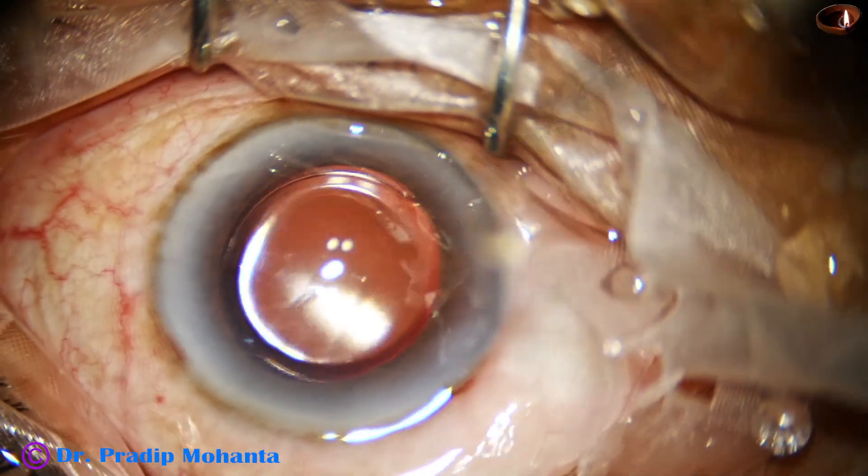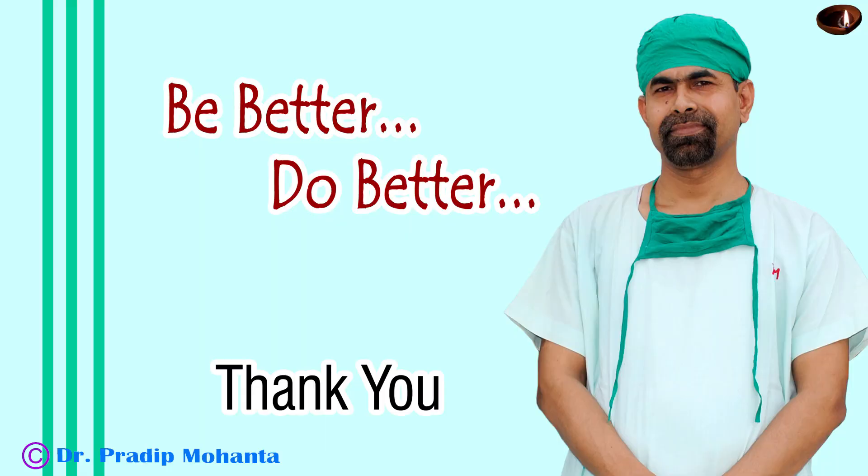Thank you very much for your attention. Hope this video will help you in developing your surgical skills, and you are going to learn pre-chopping of the nucleus.